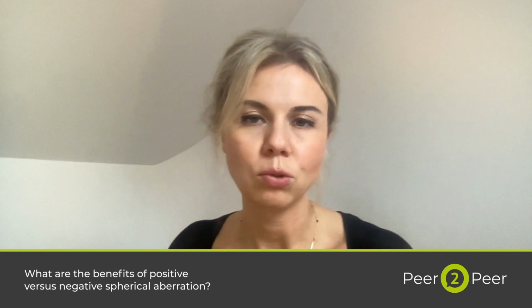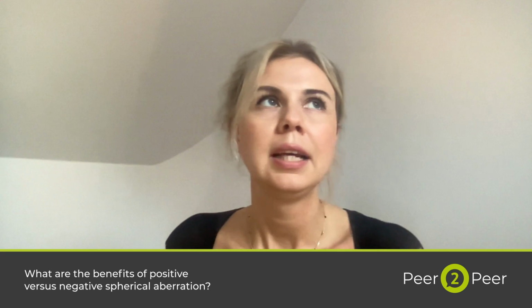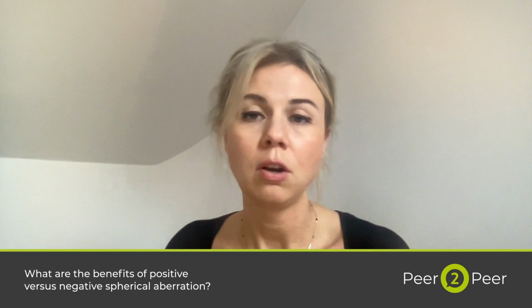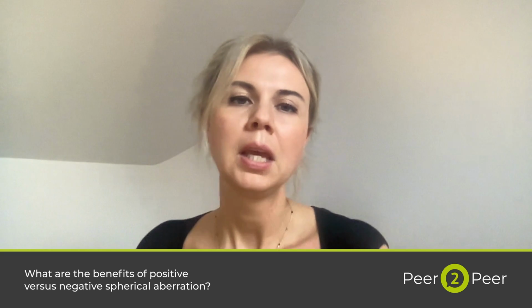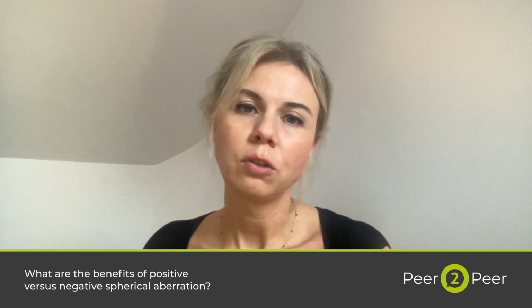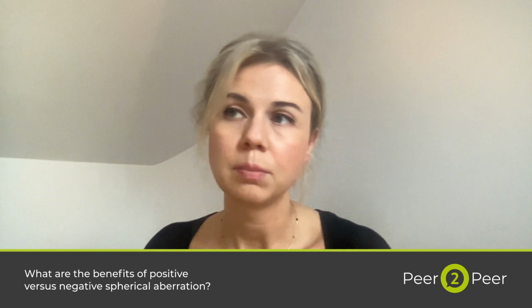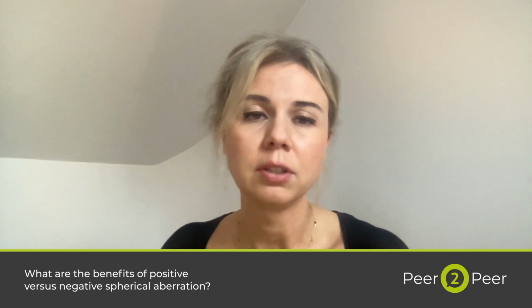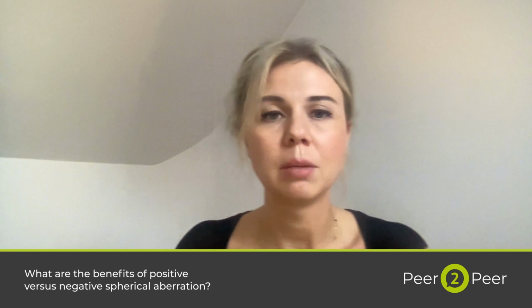Positive spherical aberration is when peripheral rays are focused in front of the central rays. We need to remember that the natural cornea has positive spherical aberration, and this stays positive for the whole life, of course without refractive surgery. So the spherical aberration of the IOL is quite important, especially in patients with a pupil wider than 6 mm, when perception of higher order aberration is much more significant.